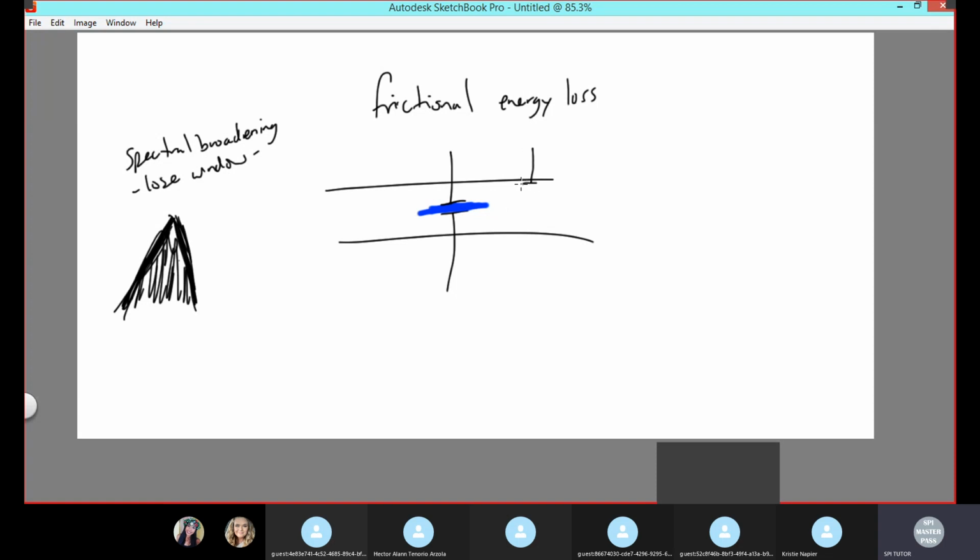If you were to grab your sample gate and put it up here, okay, now you're looking at the blood up here. And that's okay, you can look at the blood up there. But this blood is rubbing up against the vessel wall. And when it rubs against the vessel wall, that rubbing creates friction. That friction slows you down, okay? So imagine when we walk, we bend our knees so that we raise our feet. Imagine walking without bending your knees and you're just dragging your feet across the floor.